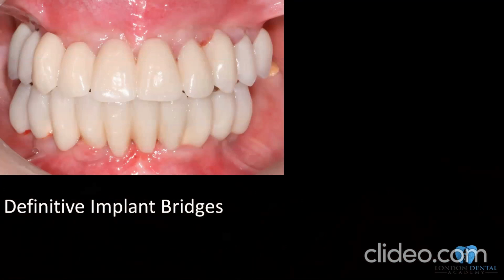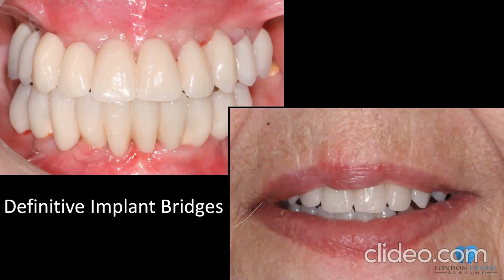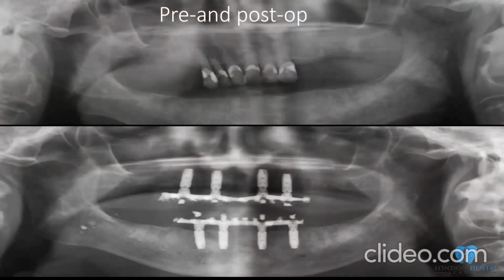As you can see, fitted, lovely, nice fit, top and lower. The gums are healthy around the implants. If I revisit this again, I would probably create a little bit more space. It's a very cosmetic, very aesthetic result, I would say. But nowadays I try to create a bit of further space. It's not visible, but I would create further space, especially in this area between the implants, just to get my TePe brushes through and make sure the patient can clean, especially with elderly people. It's a very nice smile, midline is good, upper and lower.